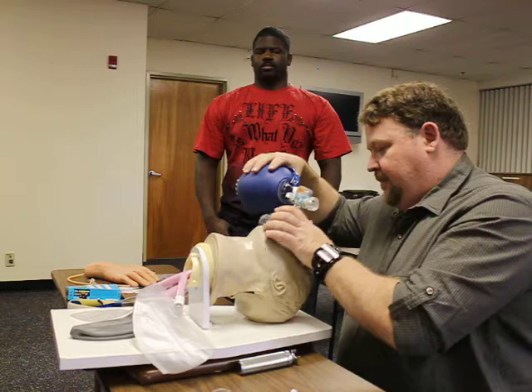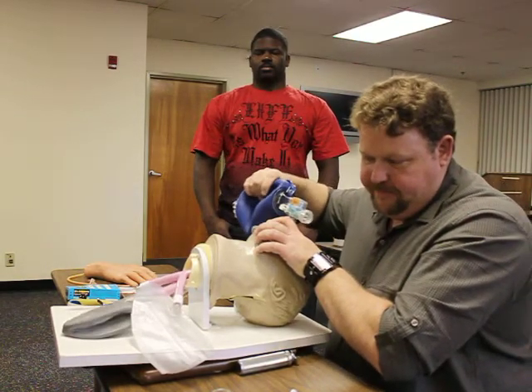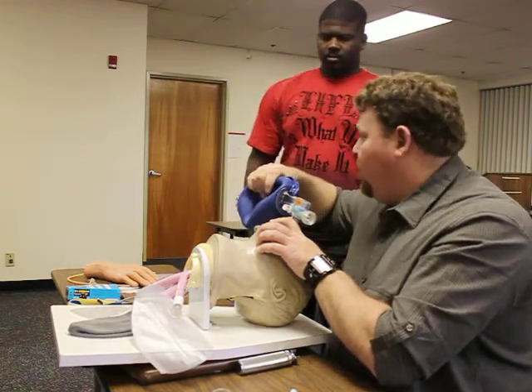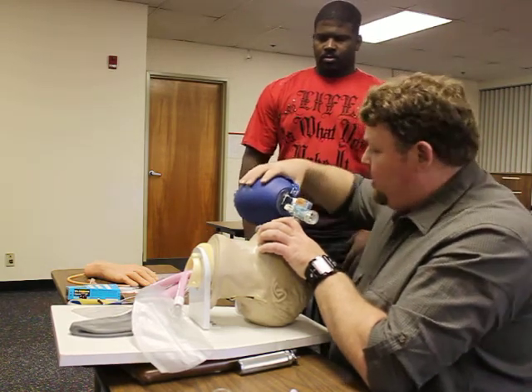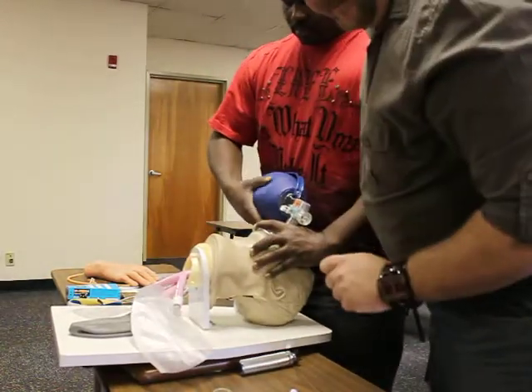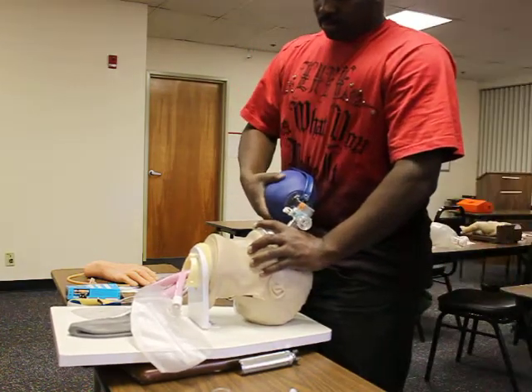I'm going to go ahead and attempt ventilation with my bag valve mask. Ventilations are going in without difficulty. Your pulse ox reads 85%, so I'm going to go ahead and attach this onto high-flow oxygen and pass this off to my partner — please provide one breath every five to six seconds. Breath sounds are equal bilaterally.